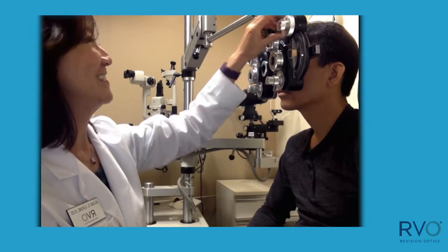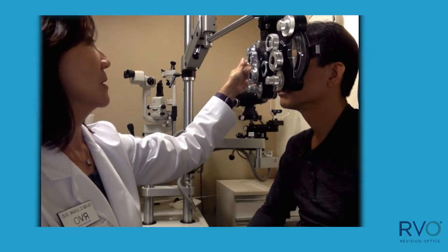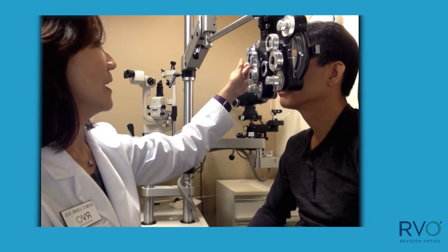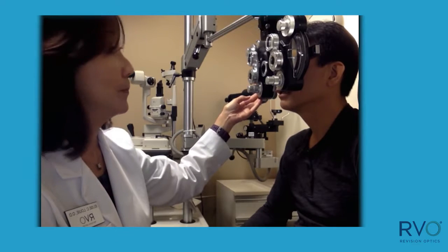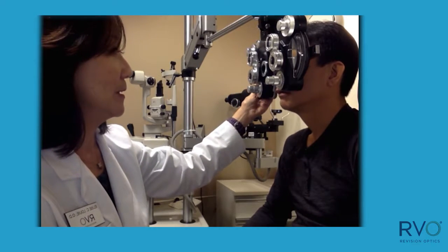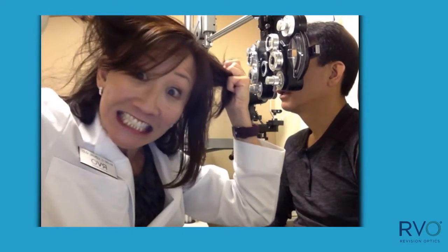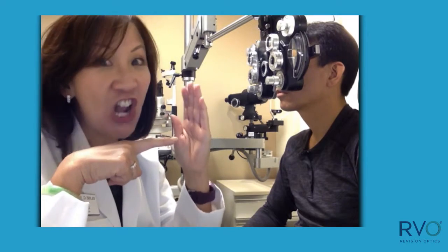Let's switch over to the other side. This time please tell me which is clearer — choice one or two? One. How about three or four? Maybe four. Let's try five or six. I'm not really sure. Five or six? I think six is probably a bit better. As you can see, this patient's endpoint is not very clean.